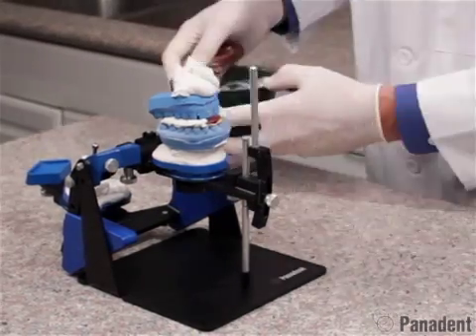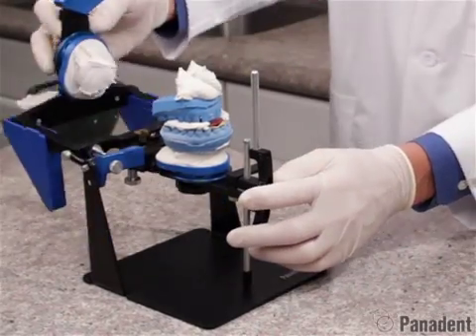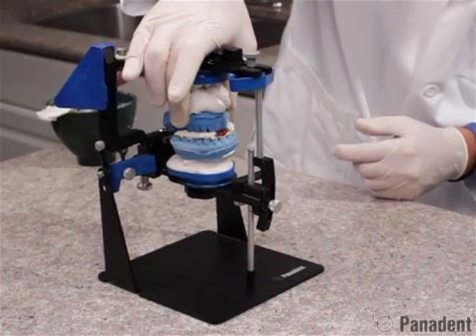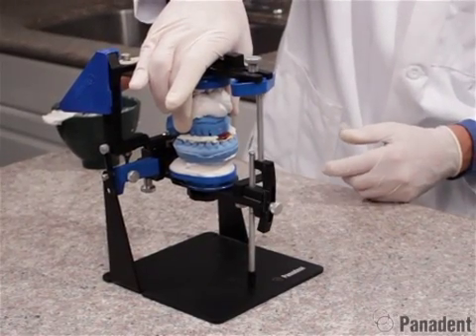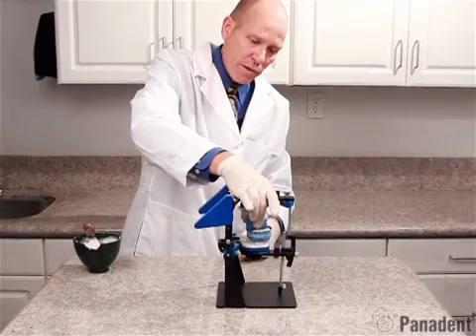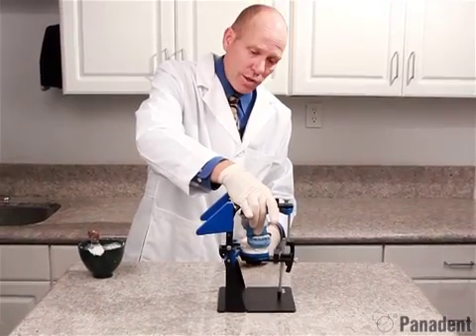All we need to do is just make a connection. So we'll swing this around, making a connection of the plaster to the mounting plate. And actually you can reach around and actually hold that lower cast into the interocclusal record for the initial set. So we'll go ahead and let this set at this time.